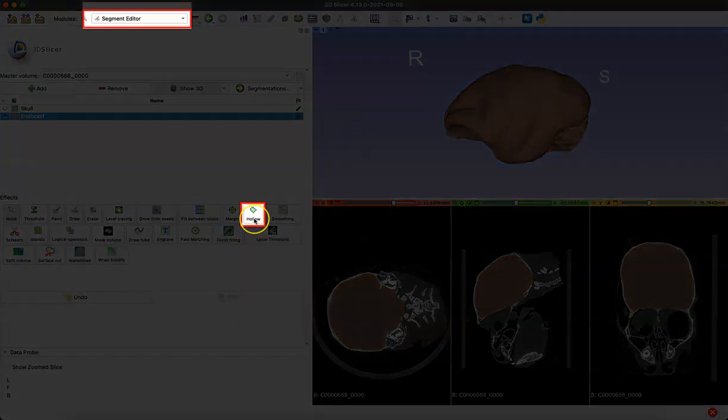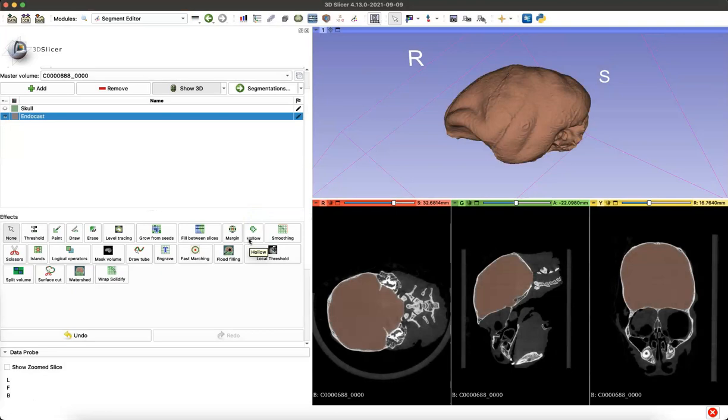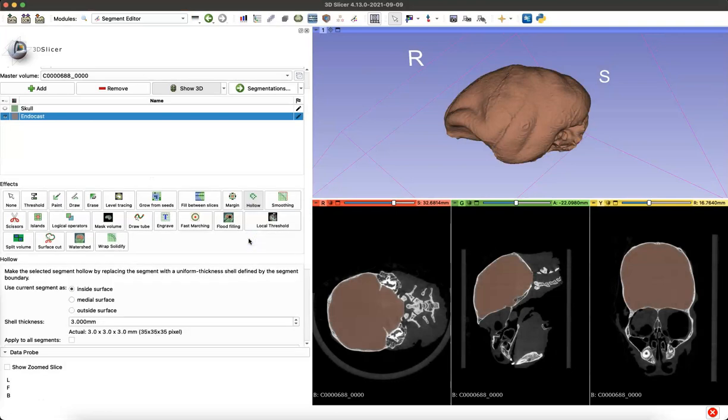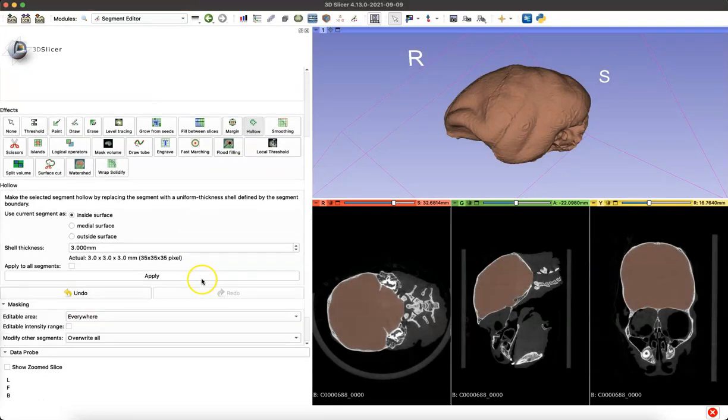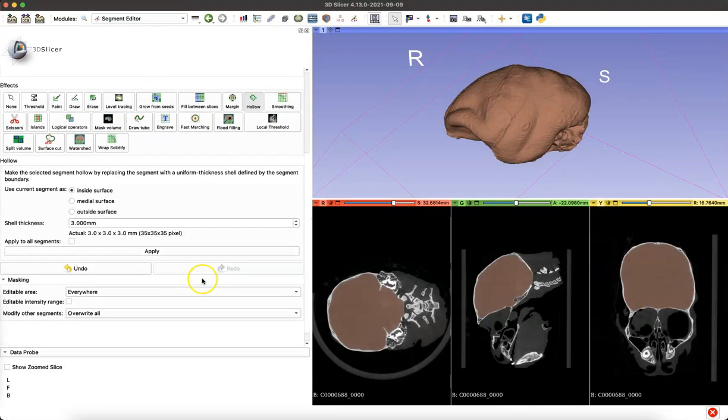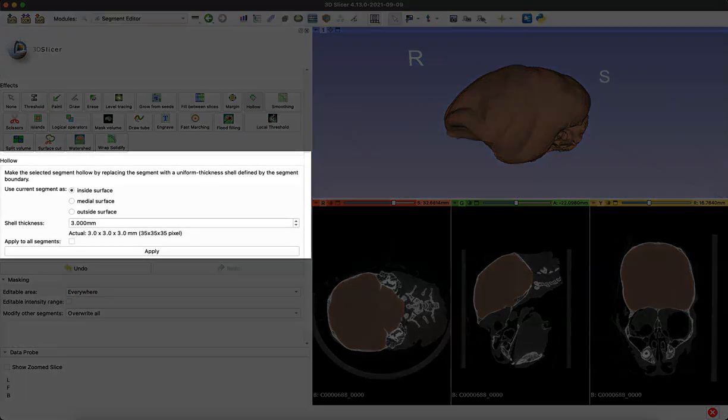We simply use the hollow tool in the segment editor module. I'm going to click on that and we can explore the settings over here on the left.